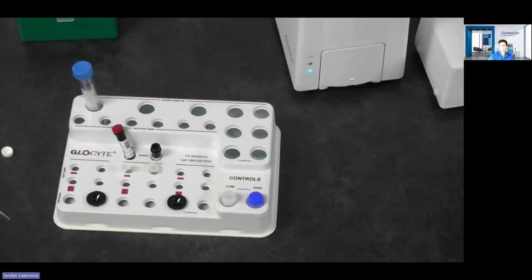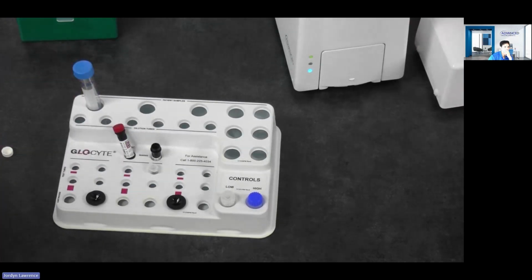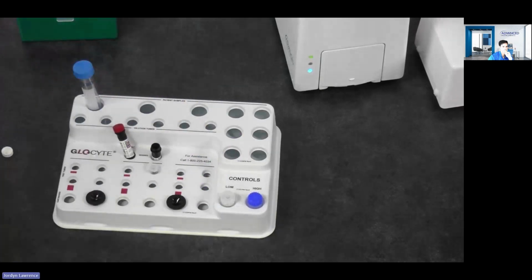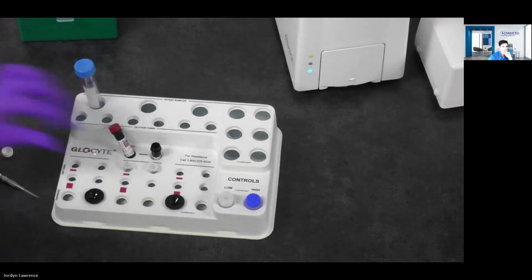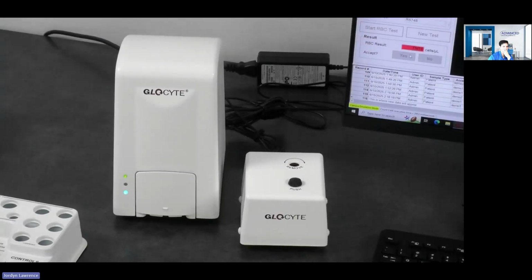Come back over here. This is my favorite because you don't have to take the sample again. You don't have to grab more reagent. All you have to do is pipette a tiny amount, 10 microliters, onto the test cartridge. I have a fantastic excuse to use my favorite button again.